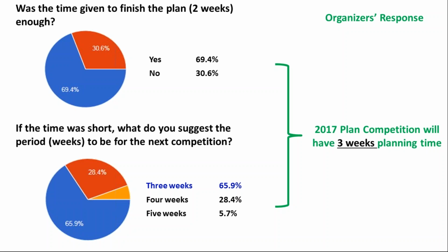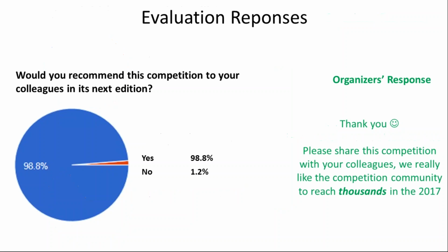Now, we would like to make it also clinically relevant, because if we make it 4 months or 4 weeks or 5 weeks, it will not be really clinically relevant. So we're trying to balance between two things, but we also understand that most planners worldwide are so busy in their clinical load. So if we said 1 week, which is clinically relevant, it will not be good enough for them, because they have clinical responsibilities they need to perform. So we need to balance between realistic as well as enough time to do a good plan.